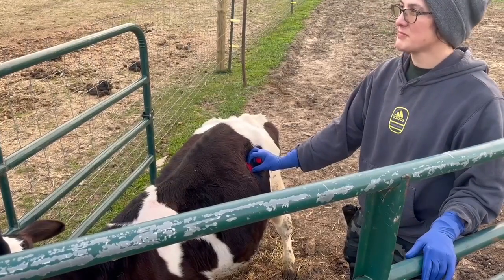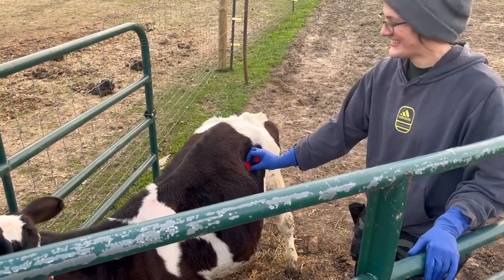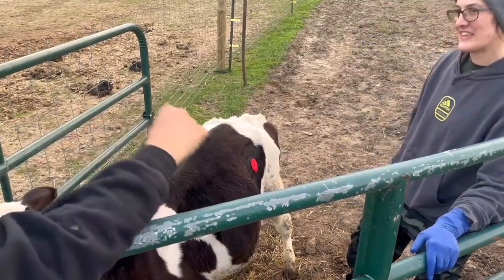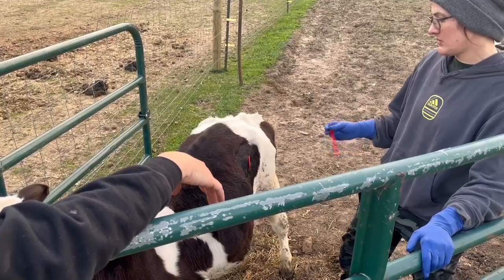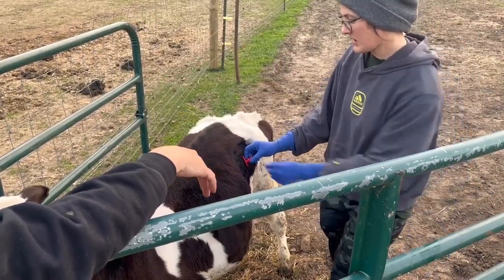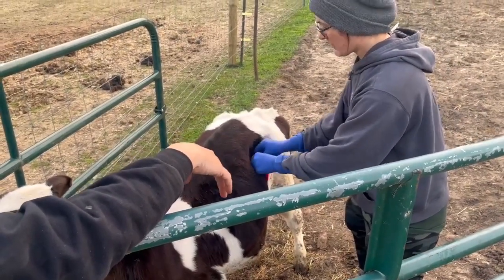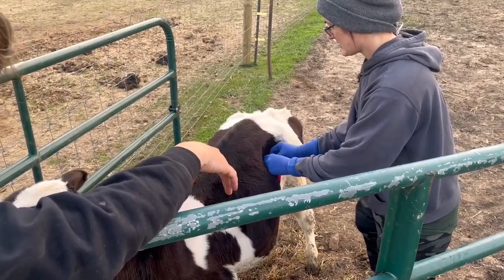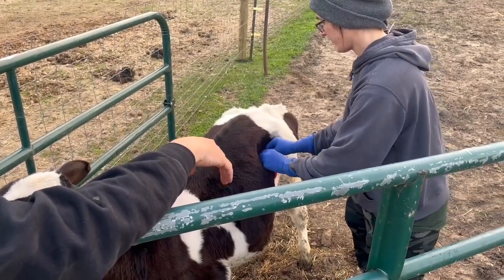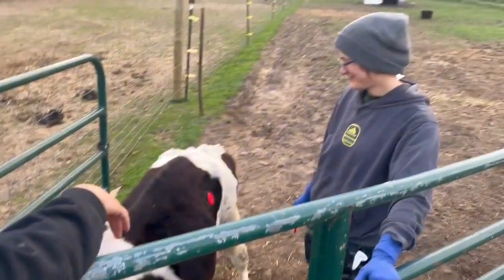I don't think she can smell it yet — oh man, you can probably smell it from there. Night and day. You can use this — I mean, you don't have much luck leaving it in, but if there's something in the way you can clear it. Hopefully this will hold; the problem is it's not gonna be super tight around this, so hopefully he doesn't fiddle around with it.